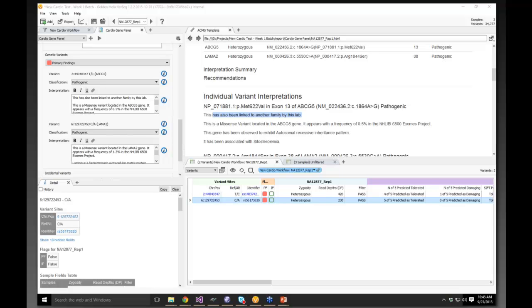But I would say that for the most part, from a clinical lab perspective, the validation work is less about worrying about these esoteric edge cases. These edge cases are often not what you're going to be fighting with. And in fact, that's often what the vendors have done for you, to avoid all that. They've already tuned their NGS callers, bundled with these desktop sequencers, to handle the edge cases of their platform. So Ion Torrent tweaks their callers to handle some of their sequencing-specific artifacts, and Illumina does the same, and you're not going to have to worry about that type of work.